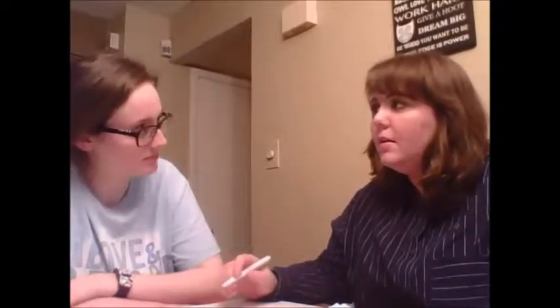Yes. Two syllabic words. And this was your ability to identify the words or repeat them to me as the decibel level decreased. Your SRT for the right ear was 35, and for the left ear was 30 decibels.